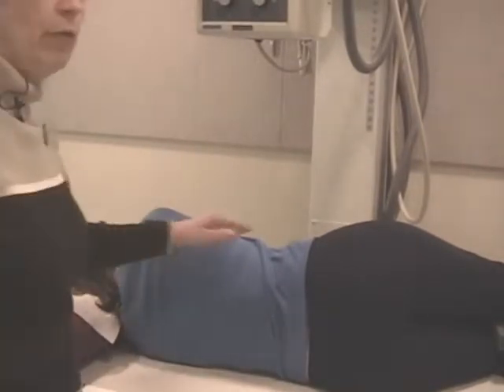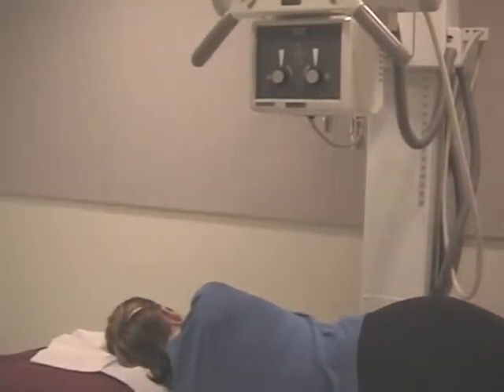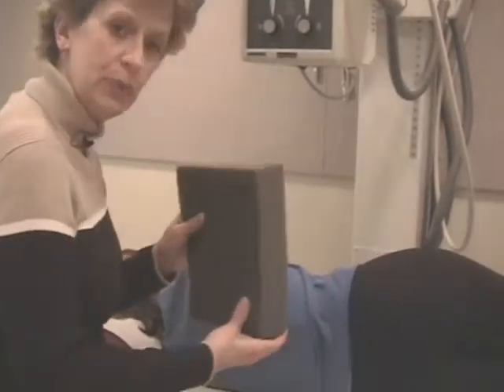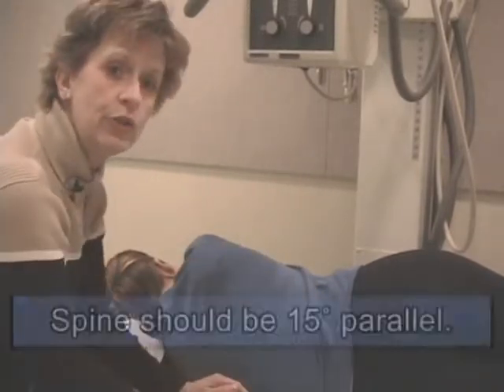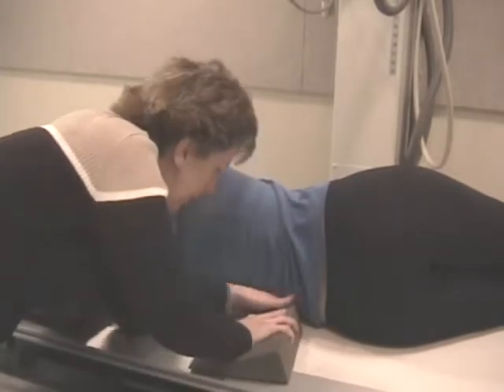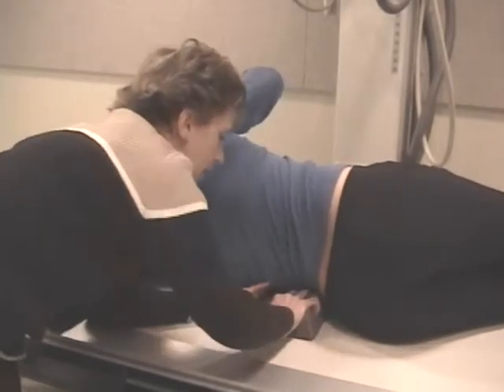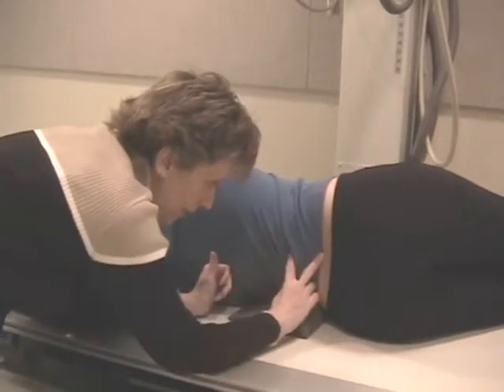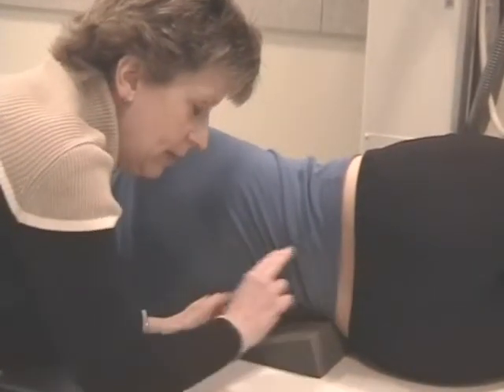We're going to do a little bit of demonstrating before I actually position for the next projection, which is your coned L5S1 lateral view. We're going to pretend that her spine was not parallel, that it was curved. You have a couple of options that you can use. I have another positioning sponge here, like a 15-degree sponge. To be more technically accurate, you should have the spine parallel. And what this does is you just have the patient lift up, and you would slide this sponge underneath their spine. Can I have you just lift up your shoulders up a little bit, Drea? Not quite. There we go. Thank you. That sponge would actually elevate the spine here, making it parallel. Okay? Use a sponge in the small of the back to make the spine parallel.